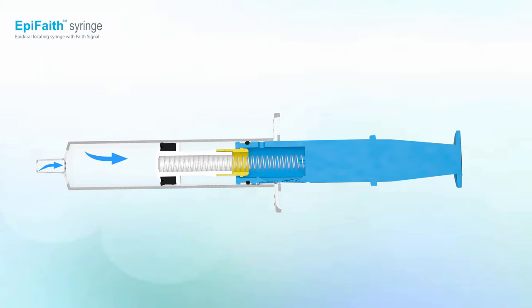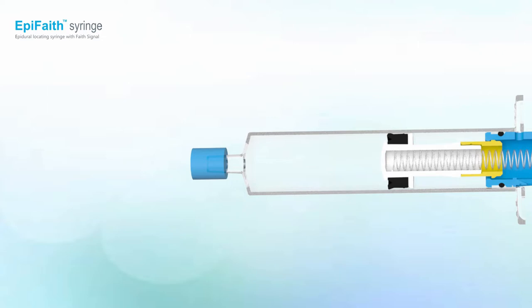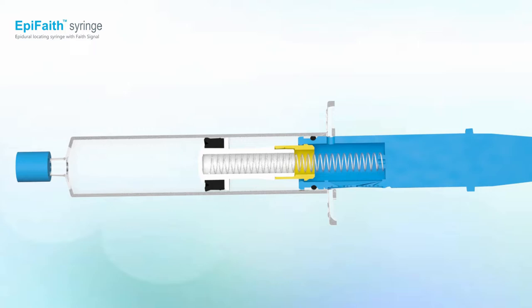Similar to conventional syringes, it can be filled by pulling the plunger. In the demo, we used a blocker to close the syringe opening to simulate when the needle tip has yet to reach the epidural space.